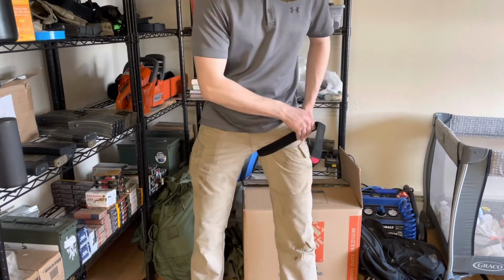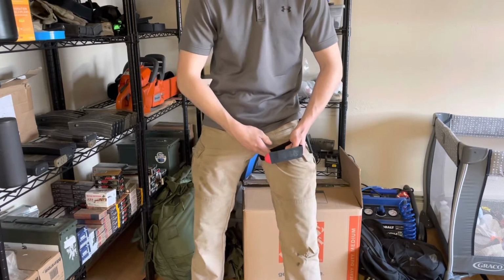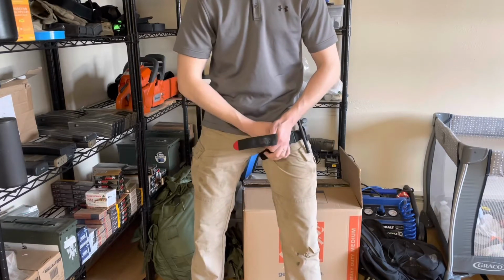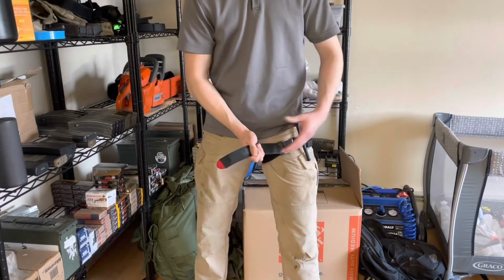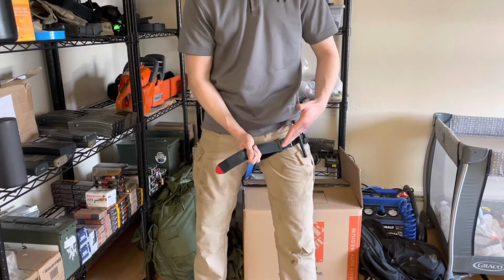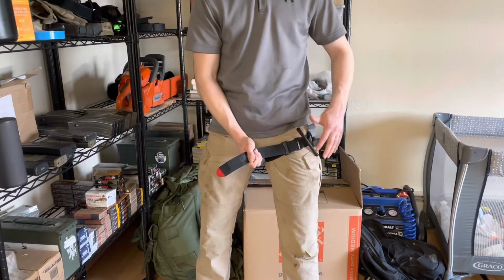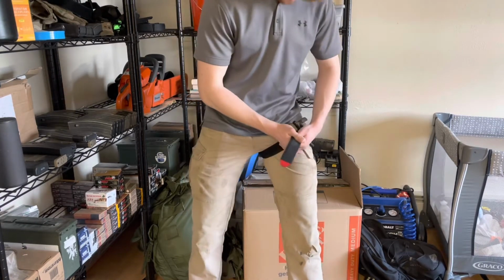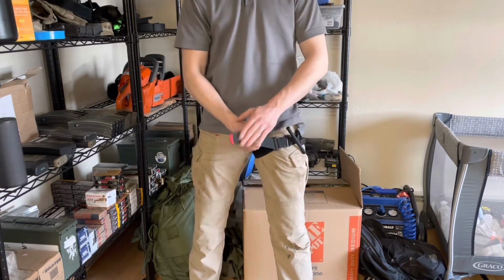So you're gonna get that initial tightening. I prefer on self-applications to push between the legs because I tend to get a better initial tightening that way than going outside of the leg. The better your initial tightening is, the less turns of your windlass it's going to take, which means the less stress on your windlass and the less time your total application will be. So you want to get this initial tightening as tight as you possibly can, and then secure your tab.